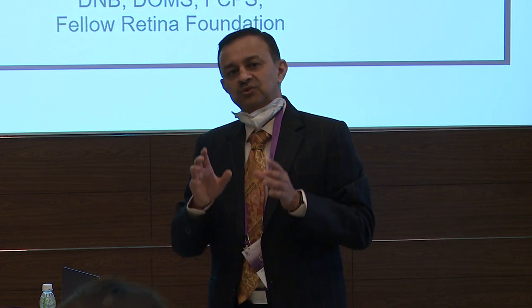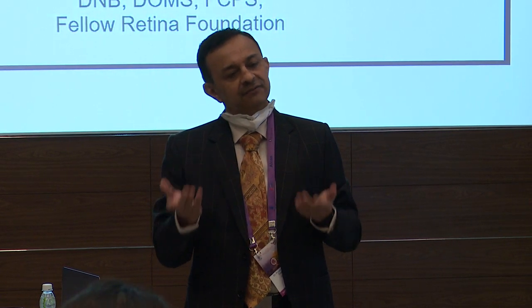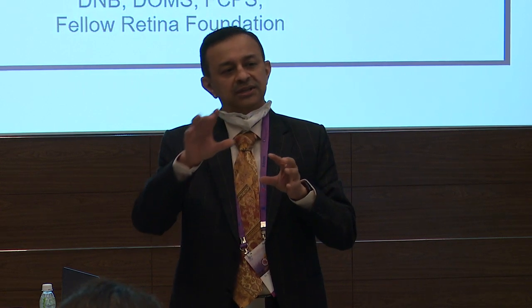So then why don't you need to do fluorescein angiogram when you have the OCT angio? See, with OCT angiography you get only the central part as of date. Even if you do a collage, you can hardly see the periphery. So the importance of today's presentation was predominantly the utility of this machine in learning why we should look at the periphery.